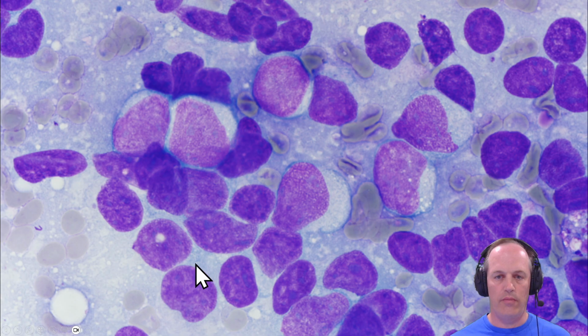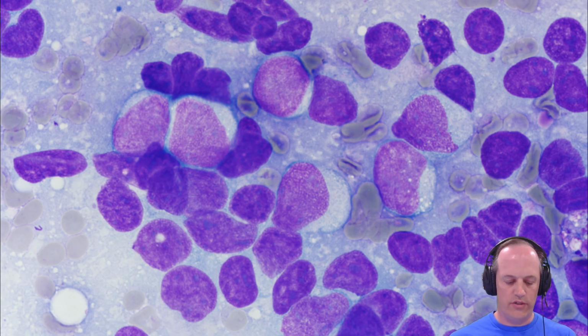So you might see a tigroid background because a lot of what's in the cytoplasm of these, if you ever look at them by electron microscopy, most of that cytoplasm is actually glycogen. So you're going to see that in the background sometimes.